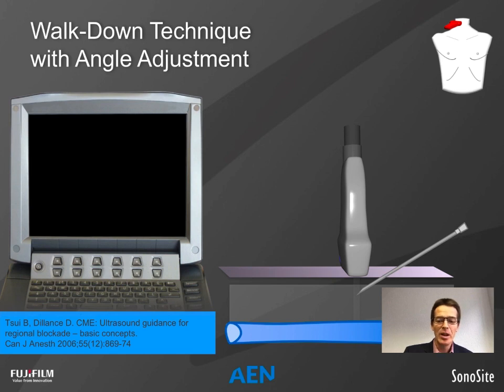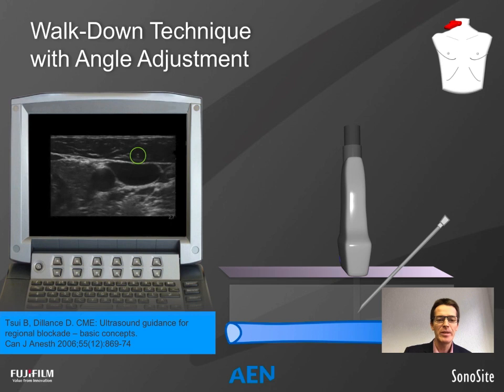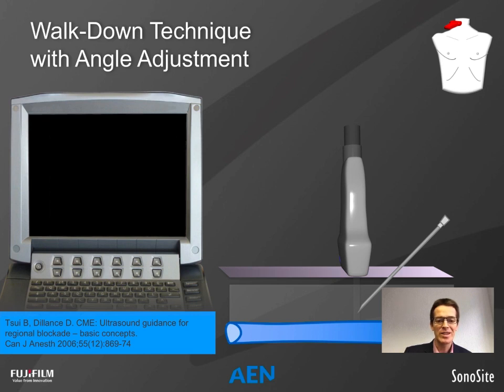And then we withdraw the needle and we adjust the angle to a steeper angle, insert the needle again until we get the first reflex of the needle tip in the scanning plane. So have a look here. The needle tip slowly approaches stepwise the 12 o'clock position of the target structure.